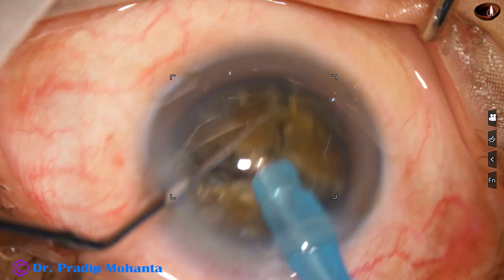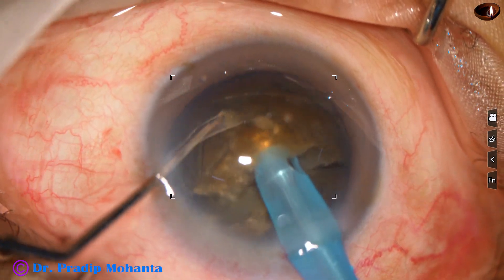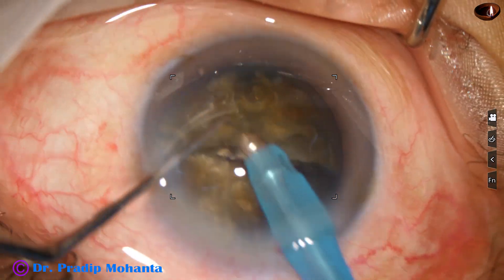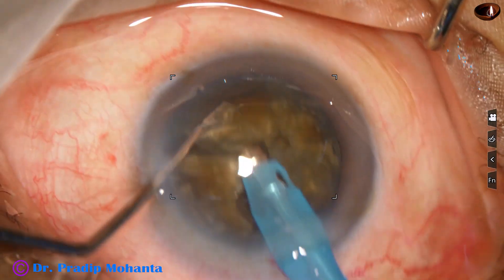One heminucleus is then divided into two pieces. The other heminucleus is also divided into two pieces, and in this case we could get free nuclear pieces.